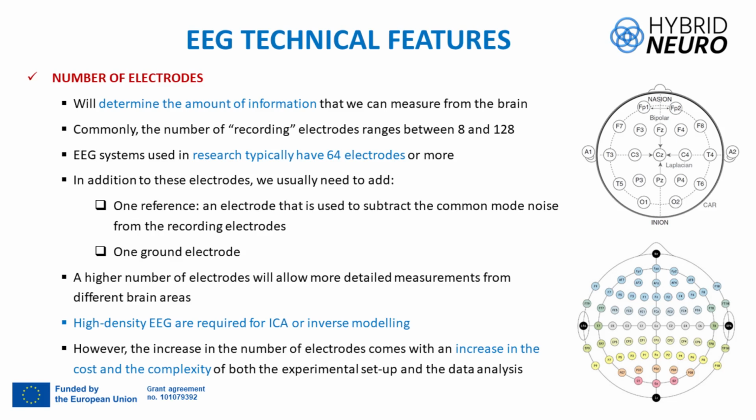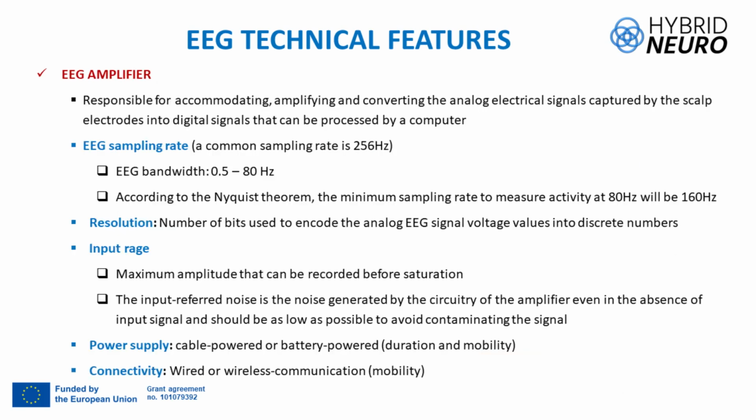Well, the bandwidth of the EEG, as we saw before, goes from delta to gamma even. We didn't mention the gamma band, but the gamma band can arrive to 100 to 150 hertz, okay? It's not very common to analyze the gamma band, but in this case, you can use a higher sampling frequency than this one, okay? But it's not necessarily a very much higher sampling frequency.